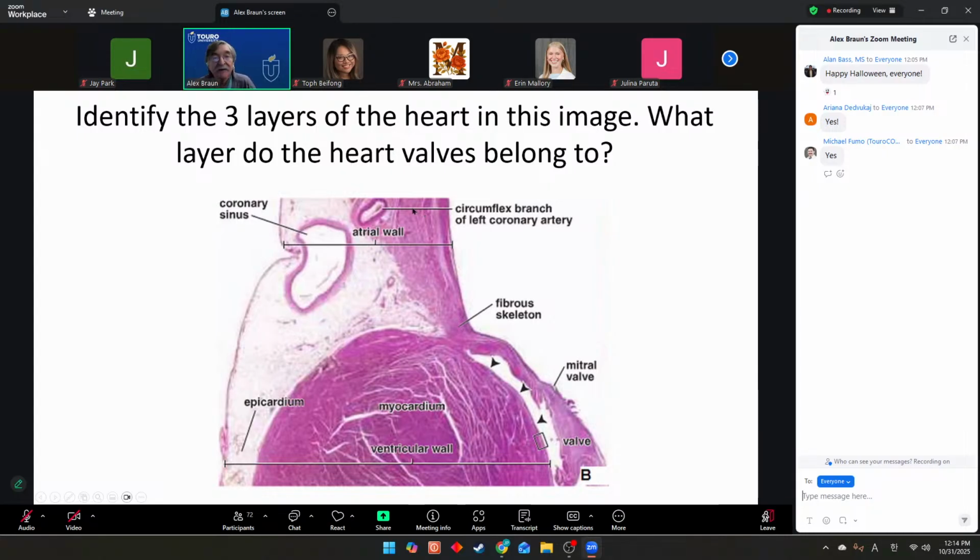There's a muscle layer here, which is part of the myocardium. A thin muscle layer is the atrial myocardium. A thicker muscle layer here is the ventricular myocardium. And you see they seem to meet at this point right here. Now, I don't really see it well, but I presume there's some type of connective tissue insulation separating the atrial myocardium from the ventricular myocardium. In other words, part of the cardiac skeleton must be there to electrically isolate the atrial myocardium from the ventricular myocardium, must be sitting at that point, even though it's hard to see.